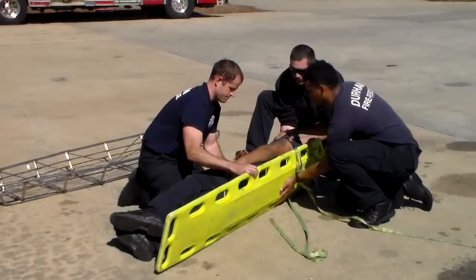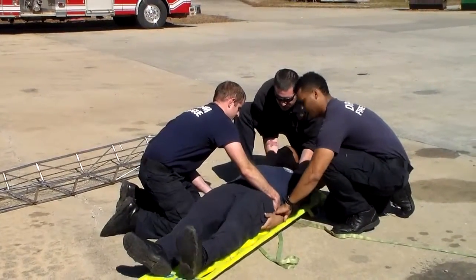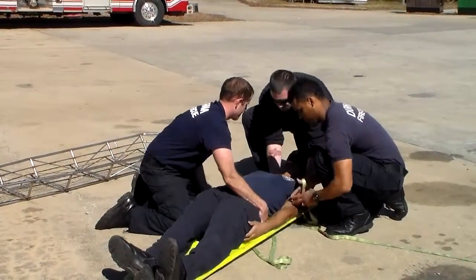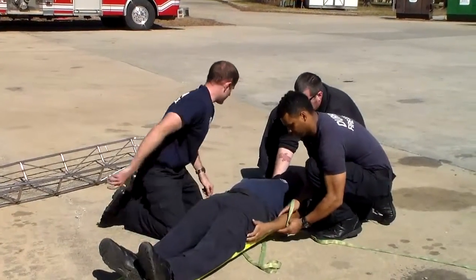Alright, ready — one, two, three. We'll go back down, slide him down, and then we'll come back up at an angle — one, two, three. There we go. Right there, perfect.